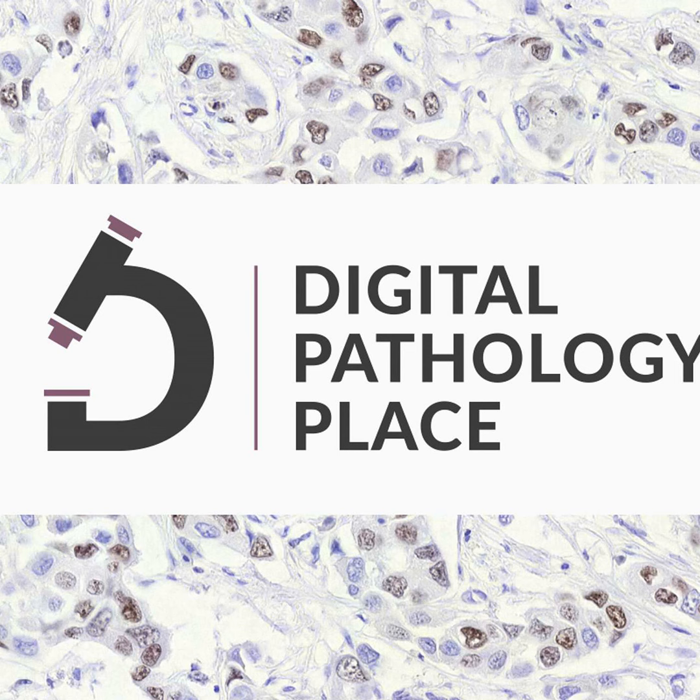It's good to realize that the repository is based on existing technology. The EGA, the genomics archive, has been in existence for quite some time, and we are adapting that technology for our infrastructure. What we are developing is a software layer, and the underlying technology probably can change. For instance, we could have different ways of storing our data.